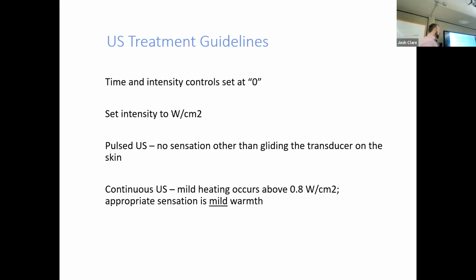Pulsed ultrasound should be no sensation other than the sound head gliding over the patient's skin. Continuous heating, mild heating will occur above 0.8 watts per centimeter square. It should be mild warmth, not hot. Another thing would be that deep aching. That's a sign that we're heating the tissues too much. So it shouldn't have any of that. It should be gentle warmth.